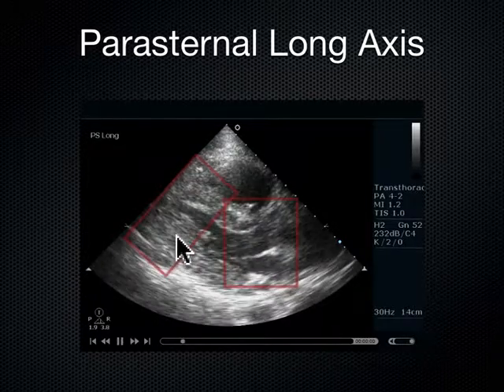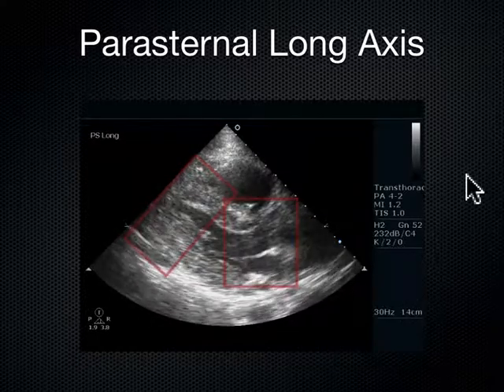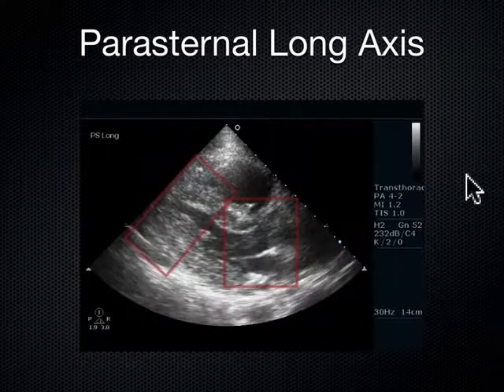We see that posterior wall, not really squeezing together very much. In fact, not really moving at all. Here's another thing I'm noticing. The right ventricle is up here. It's actually larger than the left ventricle, and in certain settings, this is a problem. Normally the right ventricle is only two-thirds the size of the left ventricle. When someone gets a right ventricle that is as big or even bigger, like in this case, than the left ventricle, that's a sign of right ventricular strain.